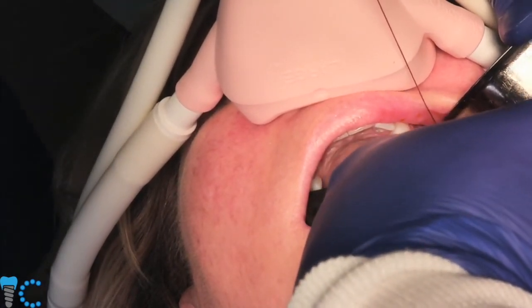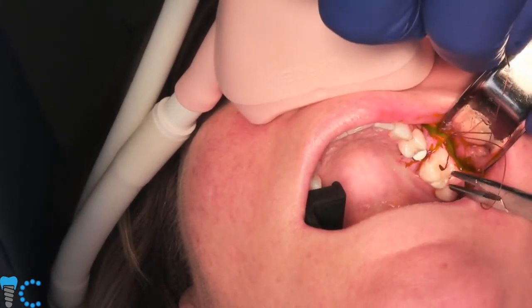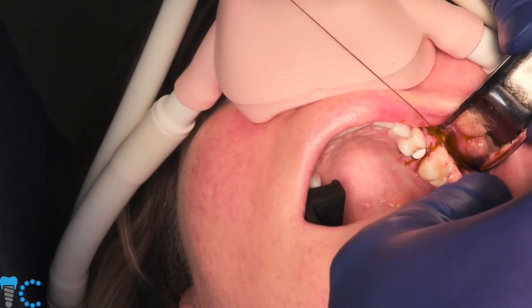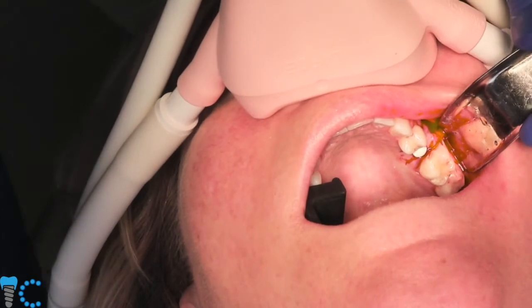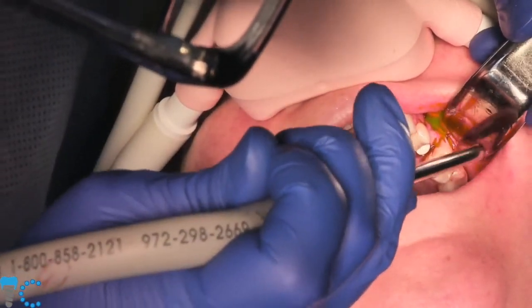It's $470, and the abutment's $180. You add that up, and you're under $700. Look at Nobel, Straumann, Astra, Zimmer, BioHorizons. You can't do an implant, an abutment, impression coping, analog, healing cap, you can't do that for less than $700.